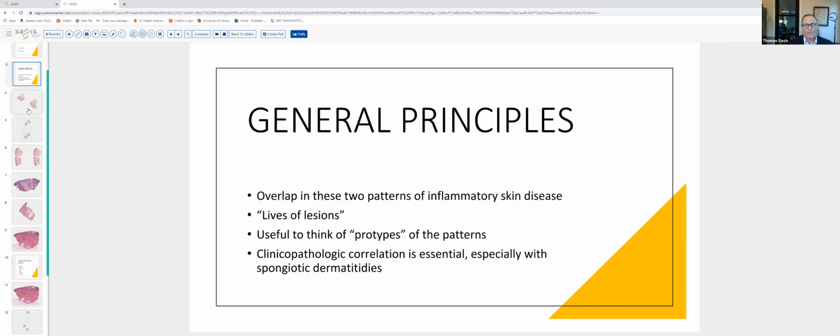And if the spongiosis or edema gets severe enough, of course, you can get intraepidermal and at times even subepidermal vesiculation. Spongiotic changes in the epidermis give rise to the clinical conditions that we call eczematous, or at times spongiotic derm.